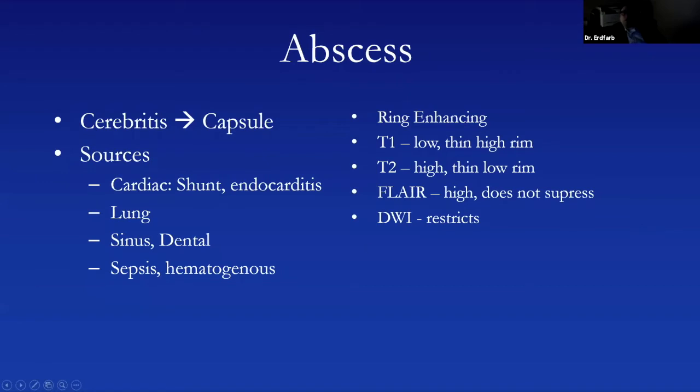And this is one of those things, though, abscess, which is a huge discussion on its own, because it really incorporates all the infectious processes. People are probably familiar with cryptococcus, when you get the gelatinous pseudocyst. Toxoplasmosis is relatively common, which can present with enhancing lesions, sometimes peripherally enhancing. Hydatid disease. Again, an entirely very well described, but lots of pictures, there's different stages.